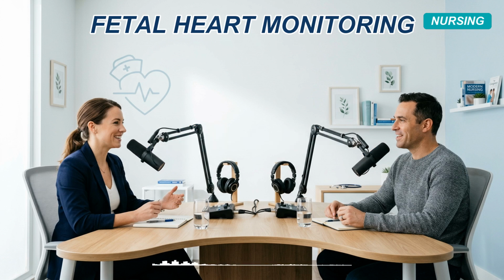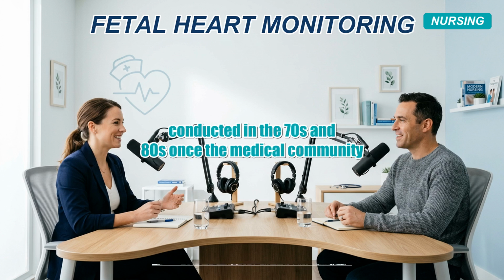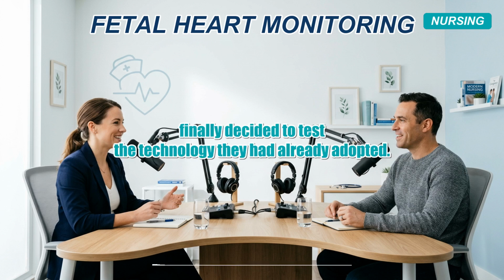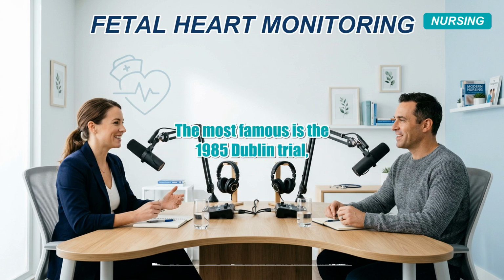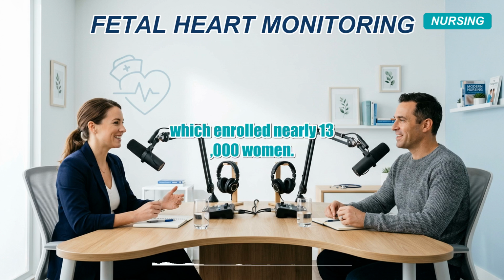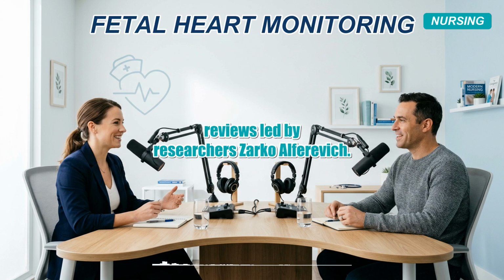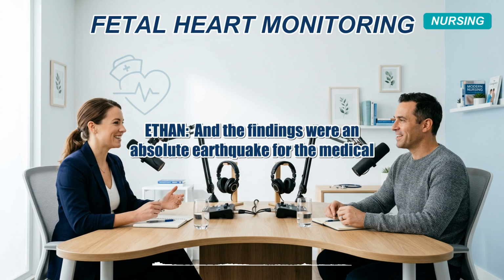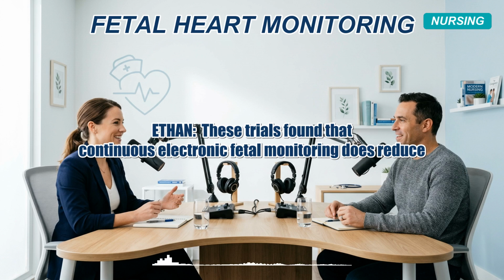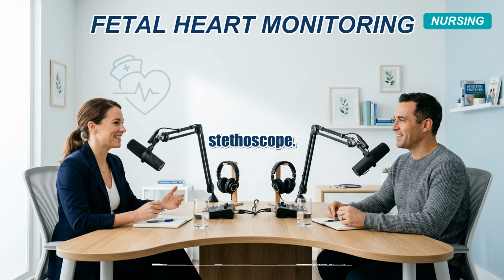Let's look at the data. The largest body of evidence comes from randomized controlled trials conducted in the 70s and 80s once the medical community finally decided to test the technology they had already adopted. The most famous is the 1985 Dublin trial, which enrolled nearly 13,000 women. Later, all these various trials were pooled into massive Cochrane systematic reviews led by researcher Zarko Alfirevic. And the findings were an absolute earthquake for the medical establishment. Oh, completely. These trials found that continuous electronic fetal monitoring does reduce neonatal seizures compared to just listening in intermittently with a stethoscope.